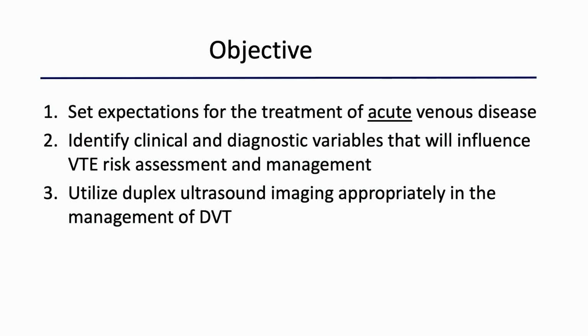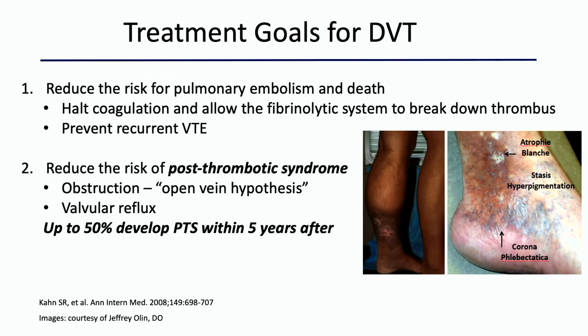I have three objectives. First, to set expectations for the treatment of acute venous disease. Second, to identify clinical and diagnostic variables that might influence your risk assessment and management of patients. And then use duplex ultrasound appropriately in the management of patients with DVT.